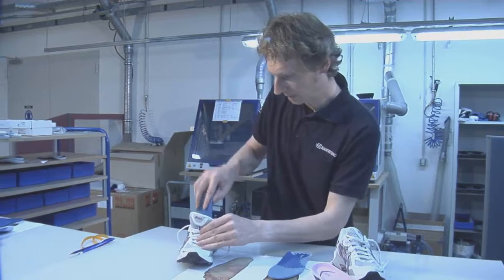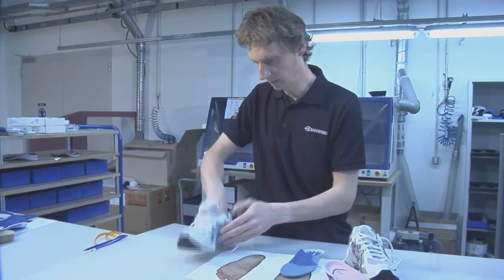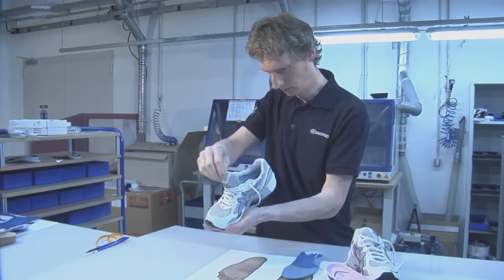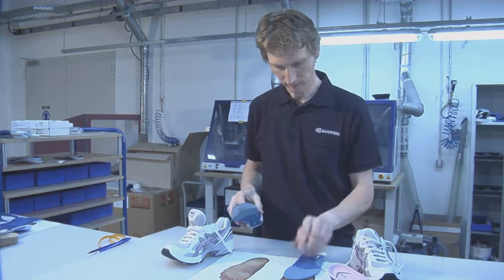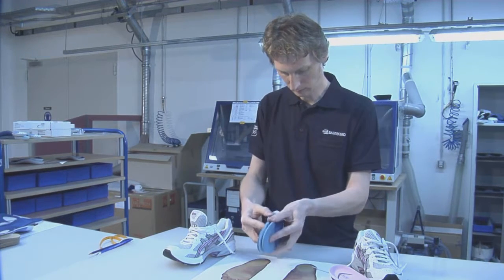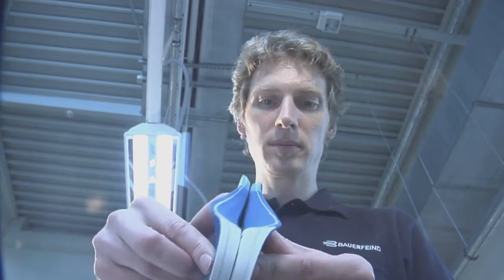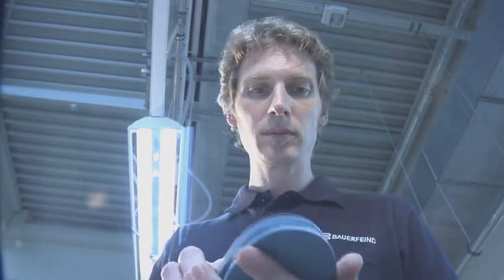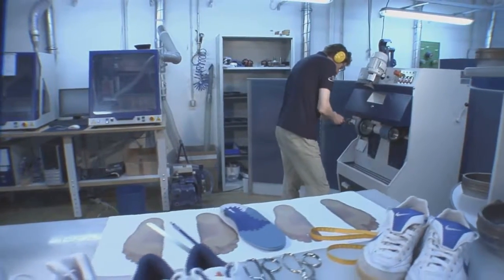Check out now whether the orthotic shape matches the inner shoe shape in terms of length and width. If necessary, modify the orthotic as needed. In cases when your customers wish only a slight supporting effect from the insert, the EVA material can be reduced below the arch support areas. The contralateral TRIactive insert has been ground in the same way before both sides are compared in terms of shape and fitting.